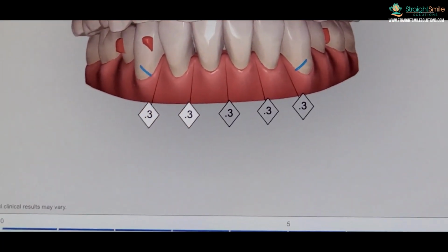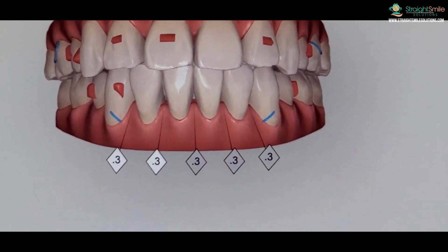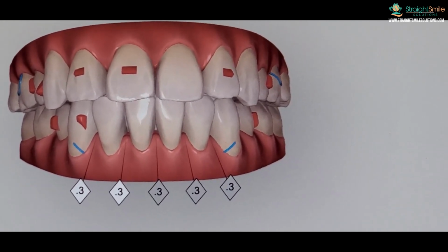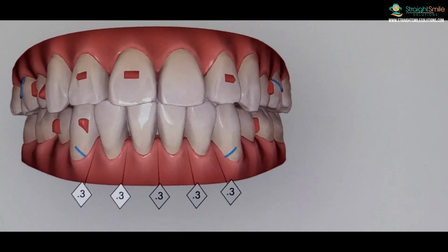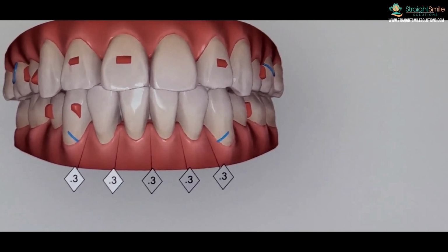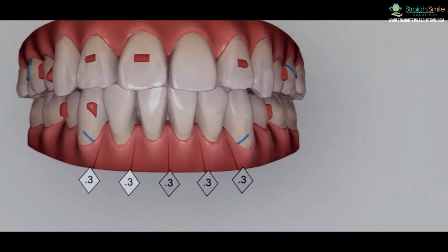Now that doesn't mean that you necessarily have to do it at appointment 2 and at aligner 10. It just means you need to do it by aligner 2 and by aligner 10. It's probably going to be slightly more accurate if you do it then, so Invisalign will tell you to do it at 2 and 10, but I do this all the time. It's fine as long as it's done by. Let's say I had a 50 aligner treatment plan and I had IPR staged at 40. Would I do it at aligner 0? No, probably not. I would do it as close to when it's due as I can, but it has to be done by the time it's due. It's like a library book. Just remember that. You have full control over the staging of your IPR on your treatment plans.